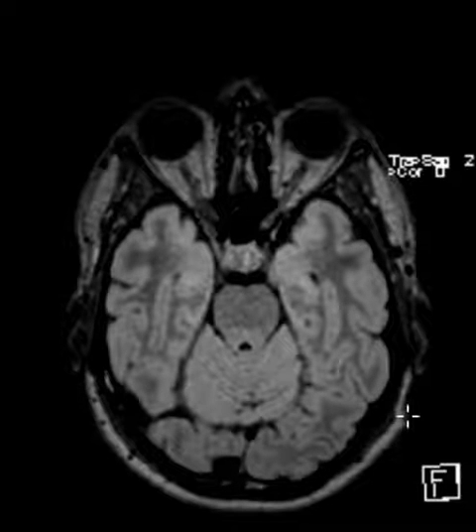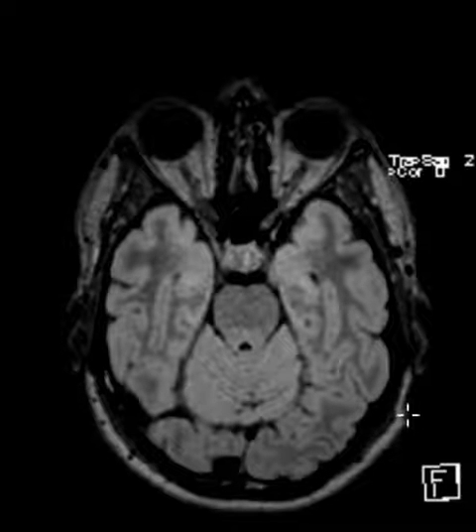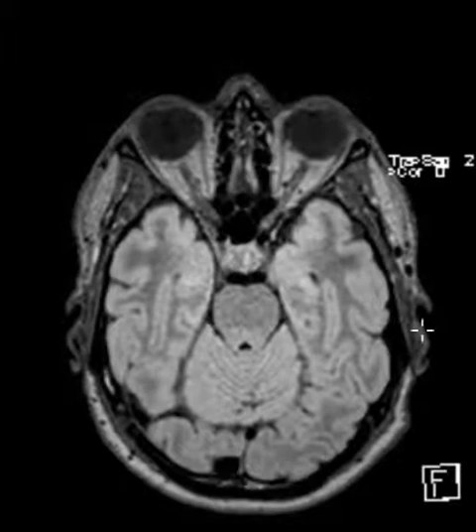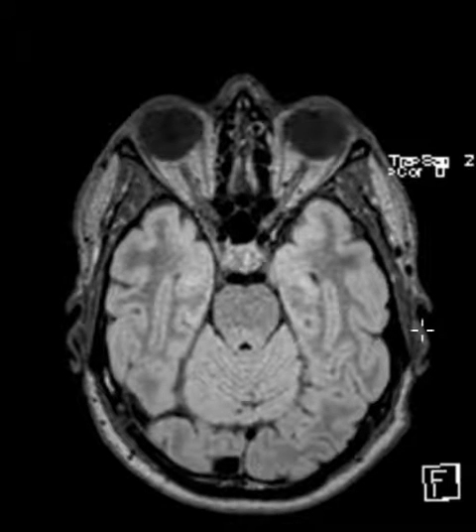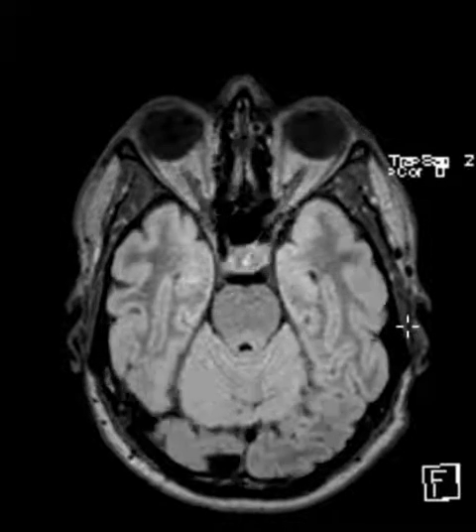Hello, this is Dr. Gay from First Life MRI, and this is a 57-year-old male with complaints of headaches. His brain looks pretty good overall, with a couple minimal findings.